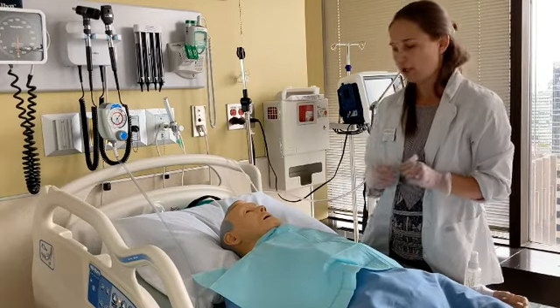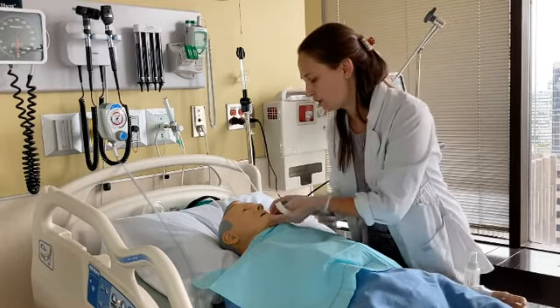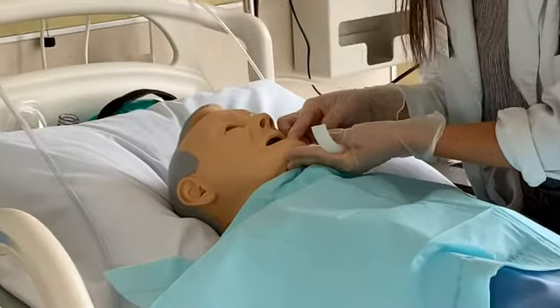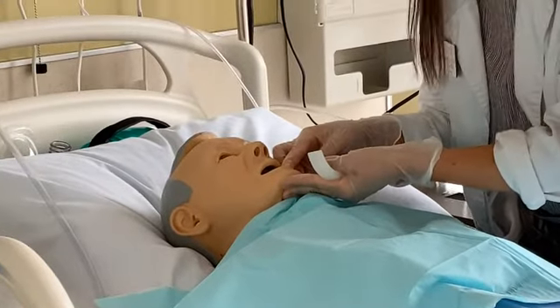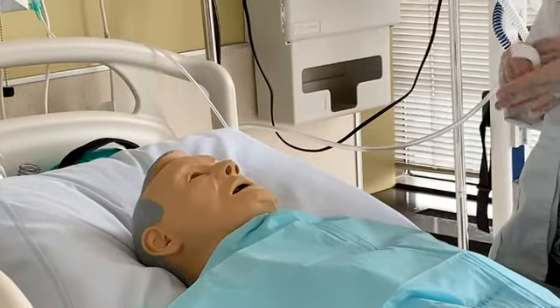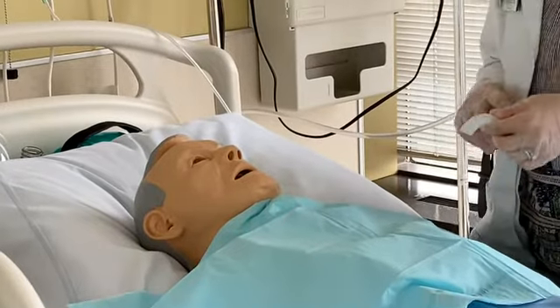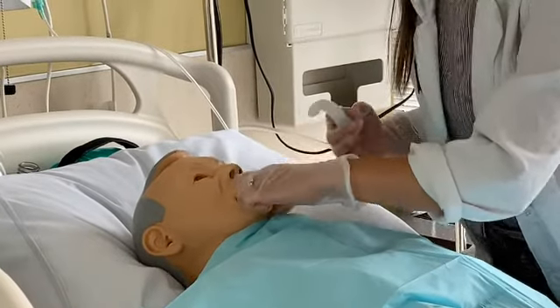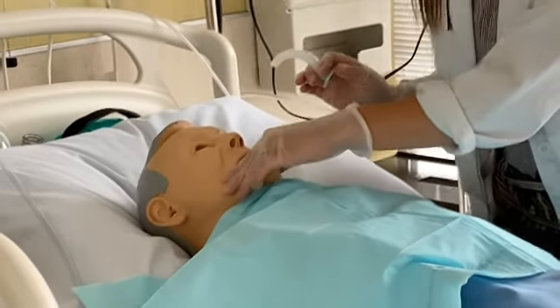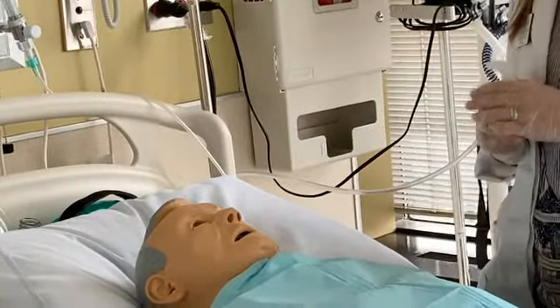So that's good. What I'm going to do next is I'm going to open the patient's mouth, and I will double check that I don't see any visible obstructions now and that the mouth is not full of secretions, because the reason why we're inserting these airways is often because the tongue is obstructing the airway or because there are a lot of secretions that we cannot get rid of right away. So there are no secretions. If there were secretions, I could use a Yankauer suction to gently suction the secretions before I insert the airway.